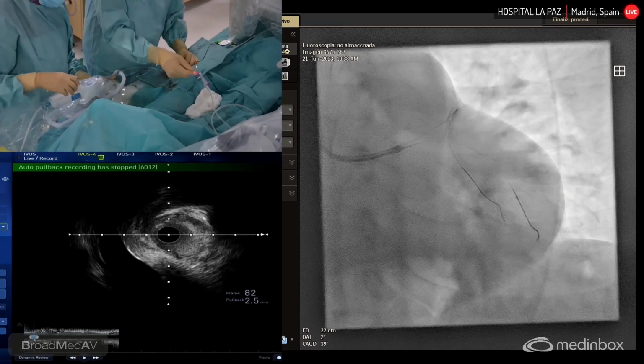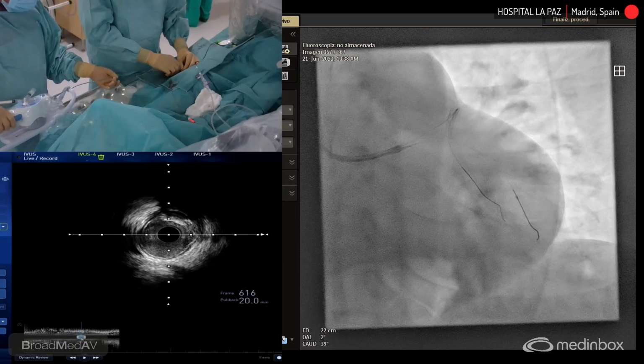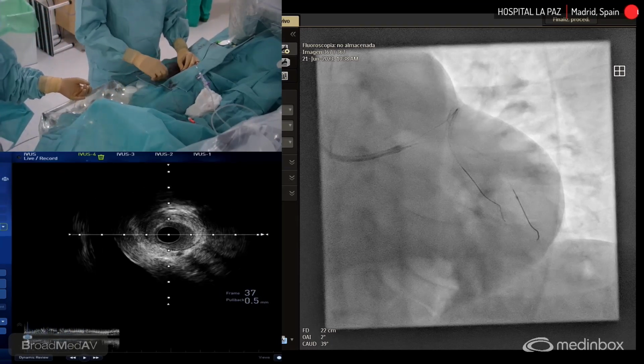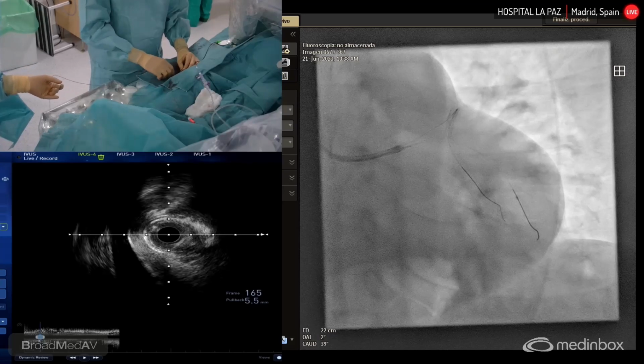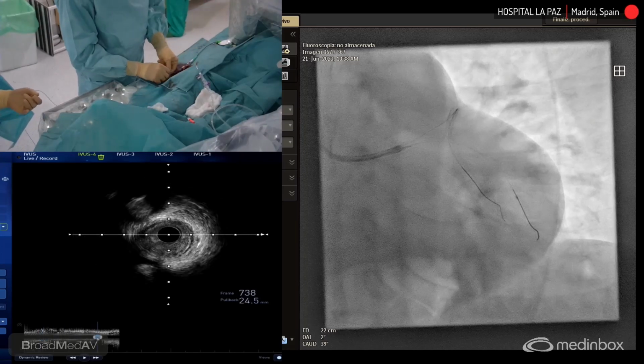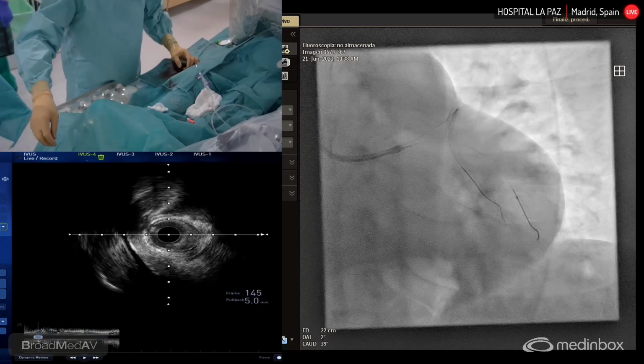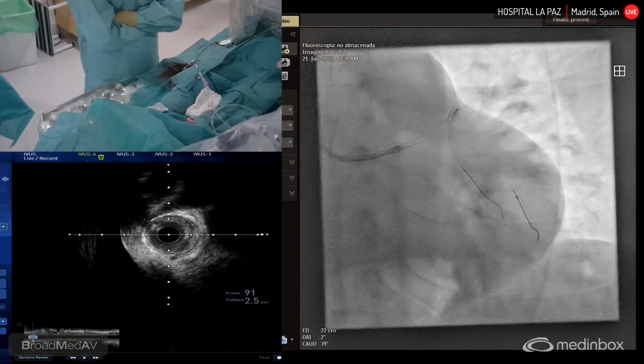So Borja, we need to analyze the distal reference diameter, because the mid lesion is for sure severe. And after that, we have to measure the severity, the area of the ostial intermedius branch. So this is a small vessel.